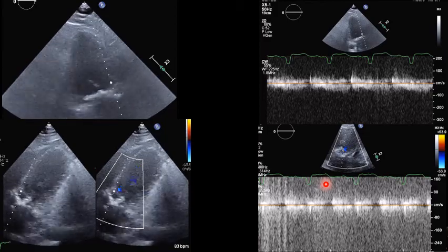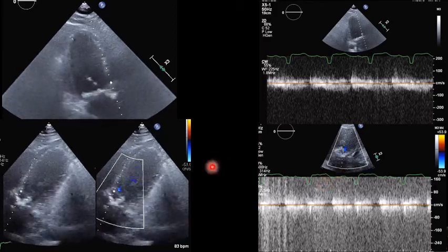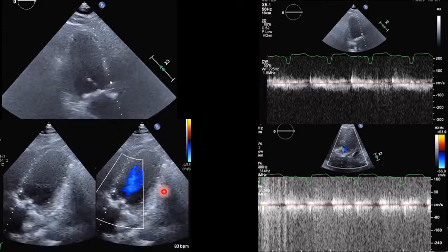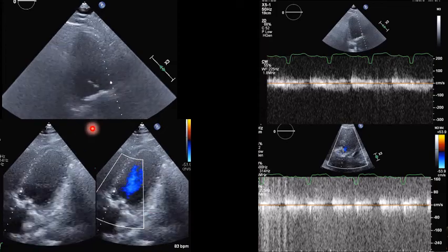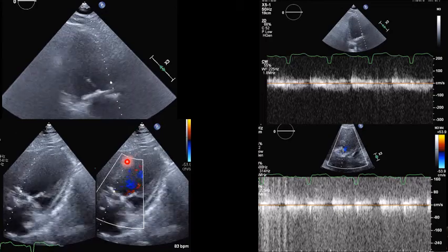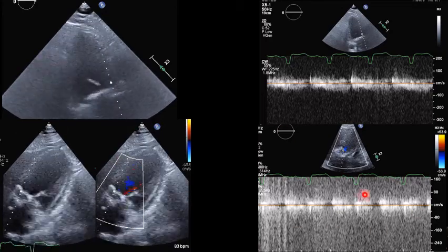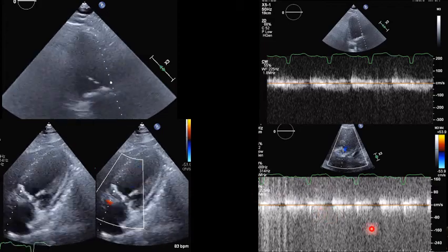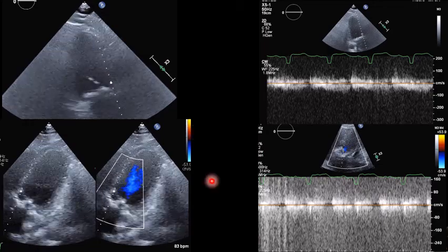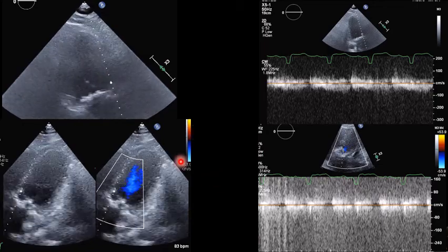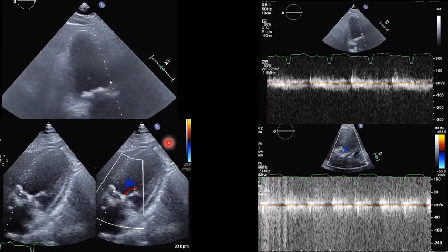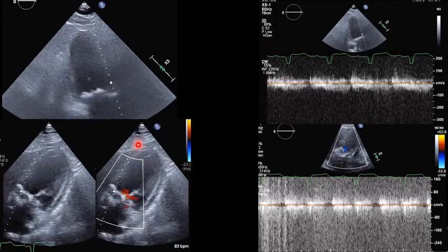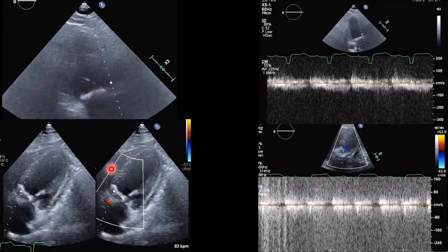Before jumping to TEE, which provides a better window, you need to consider options. We tried the Pedof probe in subcostal, apical, and right parasternal positions, but the Pedof did not give us a strong envelope in any of those views. What options do we have for ruling out aortic stenosis before going to TEE, if the patient's condition does not allow a TEE?